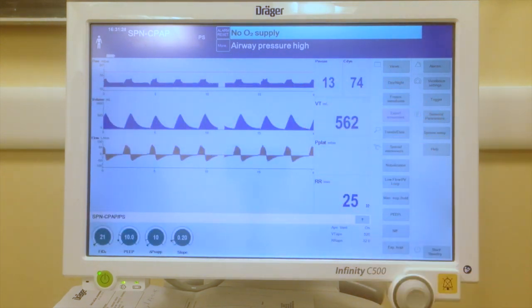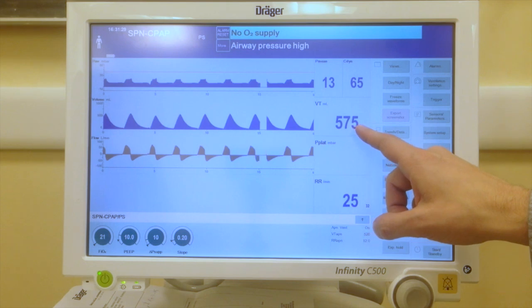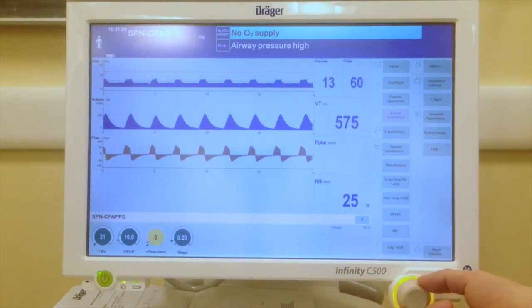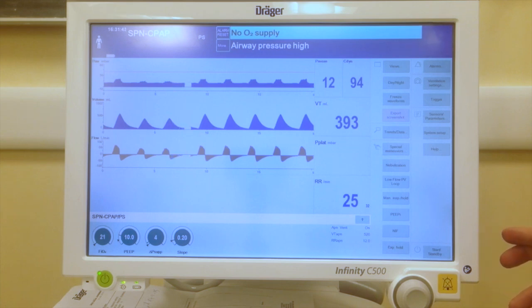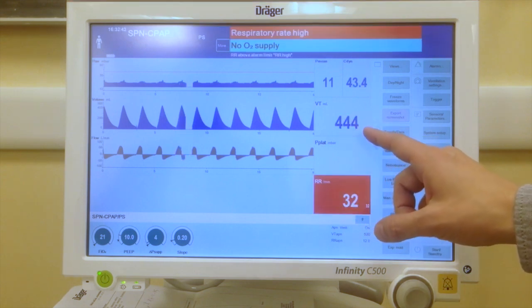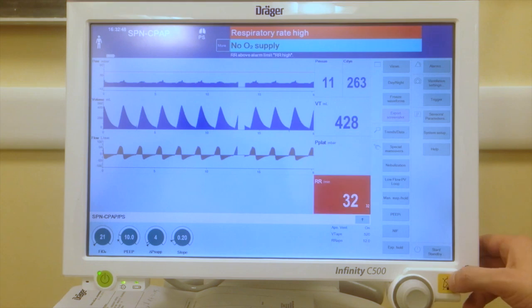This P0.1 was measured with a pressure support of 10 and a tidal volume of 575. If we want to better understand the P0.1, we can lower the pressure support to 4 and see that tidal volume has decreased and respiratory rate has increased in order to maintain the same ventilation.